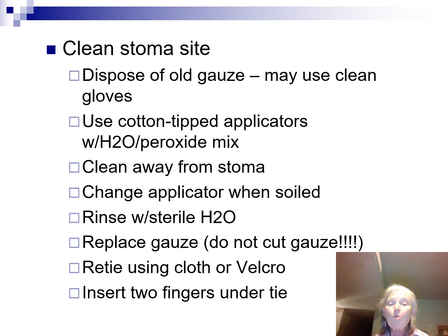Now, before you put the tie on, this is where you want to look for skin breakdown, and this is also where you want to look for an infection. So take one of your gauzes if you have them and put some sterile water and use it to wash behind the back of their neck. Sometimes when you do that, there may be some blood back there and that will come out. That's an indication that that needs to be cleaned. Otherwise, it's going to stay there and it may end up infecting the patient.